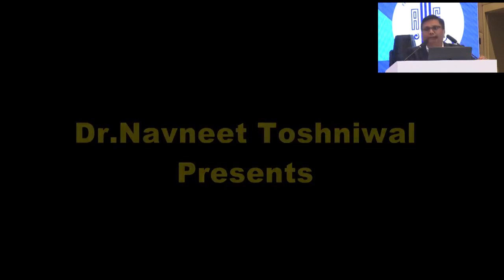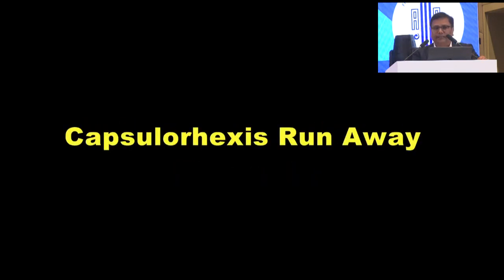So capsulorhexis runaway is something that can happen with any surgeon. You have to be ready with the instruments and think of conversion at any time. That's the final take home message.